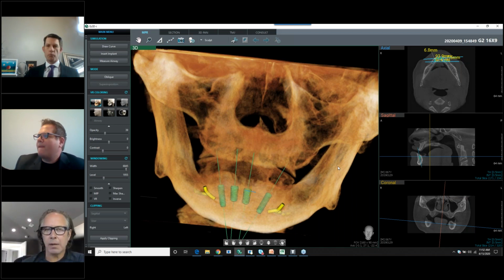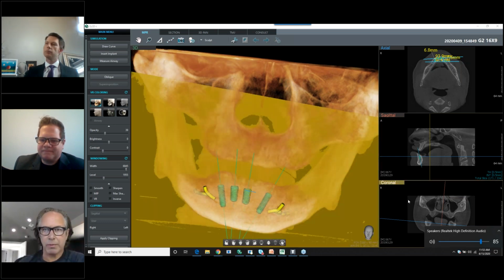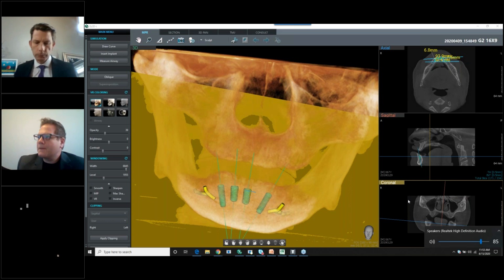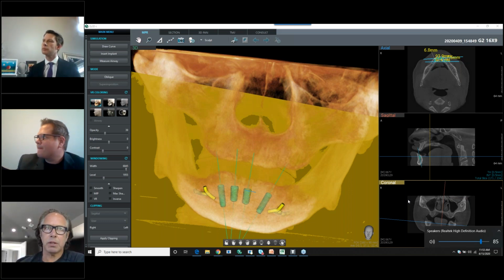Yeah. Well, great question. First of all, thank you. I was watching you guys, and you did a really nice job. So congrats on that, both of you two. I've tuned into a couple of webinars here and there, and some of them have been on 3D stuff, and it can be quite confusing to the beginner. And so I think you guys have done a really nice job of not only teaching the software, but speaking at a level where everybody has some interest. So thank you both, and thank you for calling on me. So a couple things.